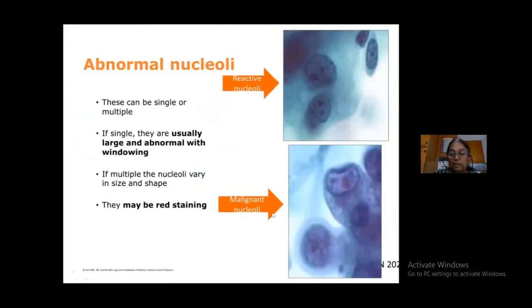What about nucleoli? Malignant nucleoli versus reactive nucleoli. Malignant nucleoli have windowing, and are also large and abnormal, and the nucleoli are more often red nucleoli.